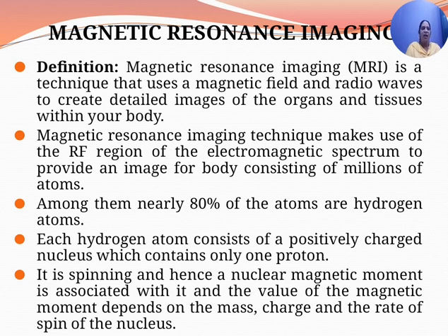Each hydrogen atom consists of a positively charged nucleus which contains only one proton.